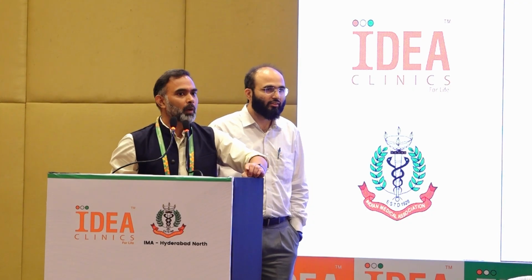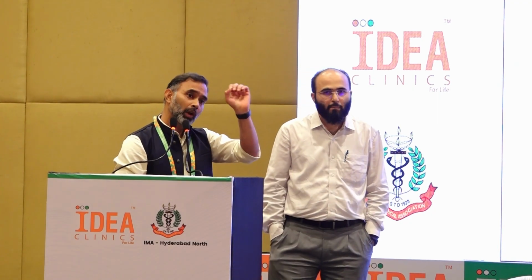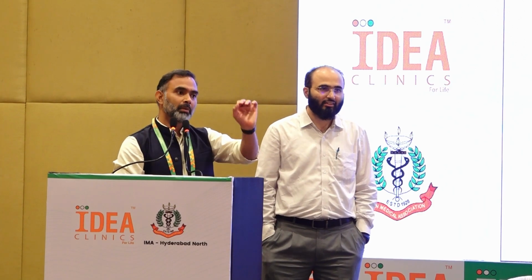6 lakhs. How to detect it, sir? Detect what? Malfunctioning? The pump has a lot of alarms. It will give you an alarm at every stage. Yes, the Medtronic support is very good. 24/7 they help. And we always tell the patient to have a basal insulin backup just in case the pump fails. Loopholes will be corrected by the pump itself. What? The loopholes, I mean. It won't be corrected, it will be detected.